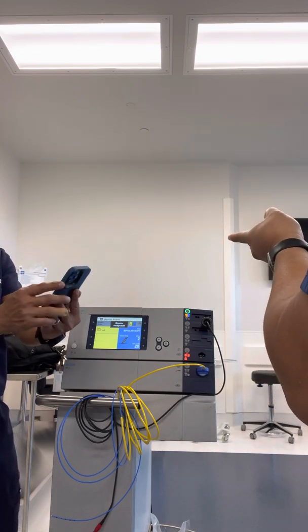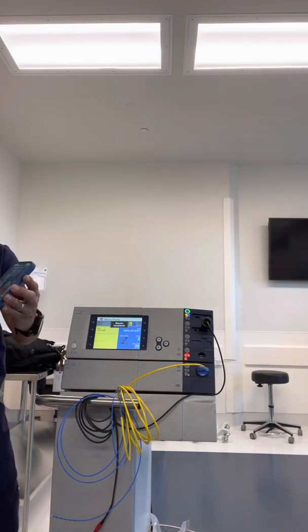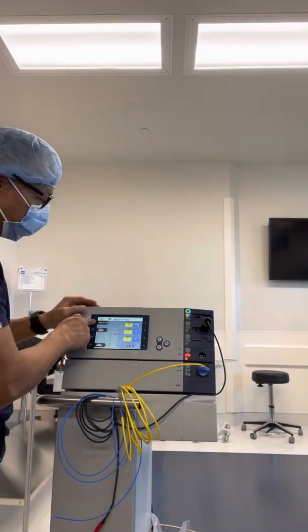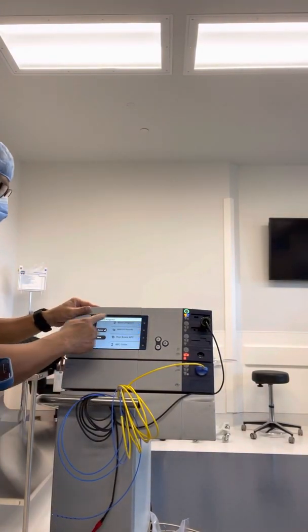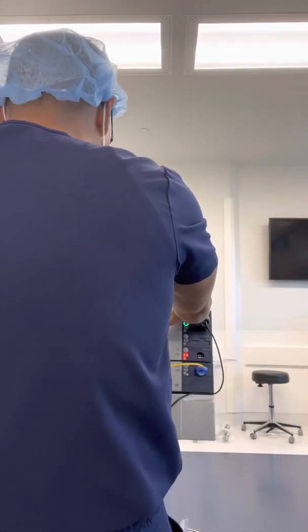Before we finish, let's put Hussein's setting on here — he has a special setting. He wants pure cut: 20, 20, zero. I could do it manually, but let's just have that setting saved for him already.